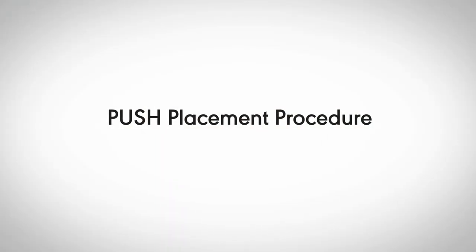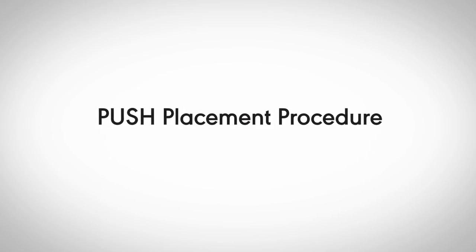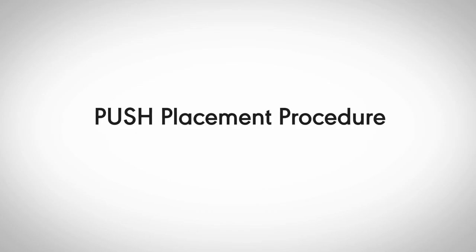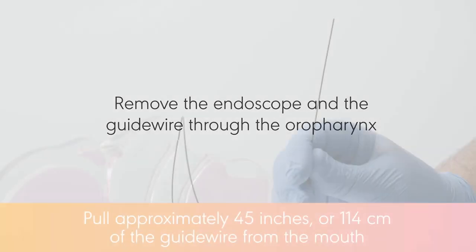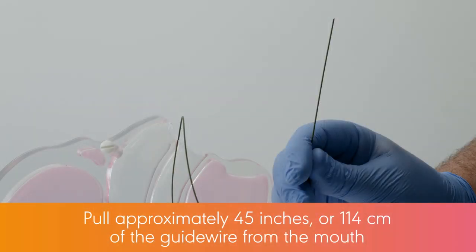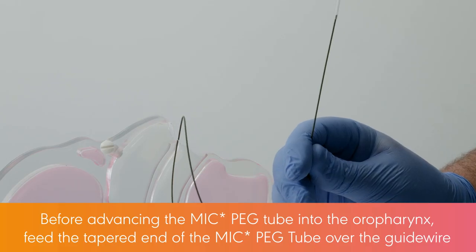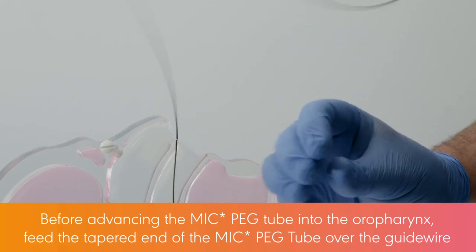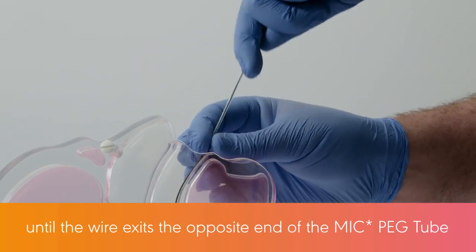Procedural steps for the push technique are the same as the pull technique until the guide wire is being pulled from the mouth. At this point, complete the following steps. Remove the endoscope and the guide wire through the oropharynx. Pull approximately 45 inches or 114 centimeters of the guide wire from the mouth. Before advancing the MIC-PEG tube into the oropharynx, feed the tapered end of the MIC-PEG tube over the guide wire until the wire exits the opposite end of the MIC-PEG tube.